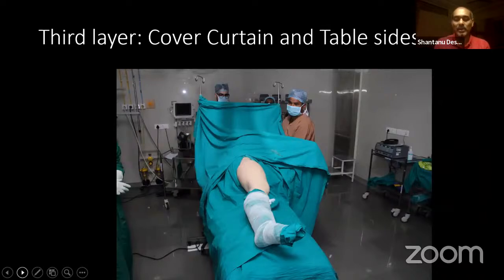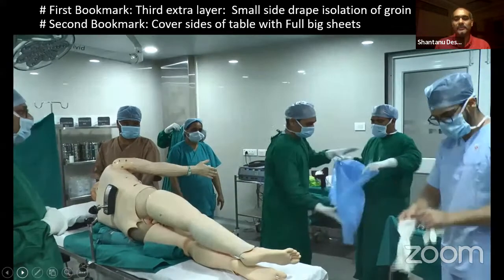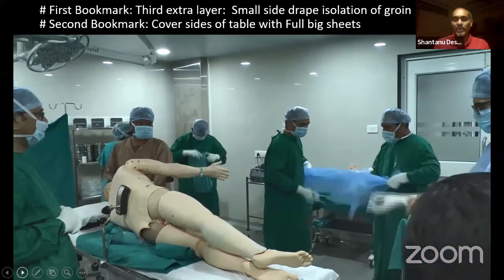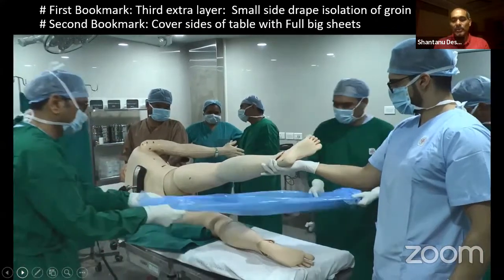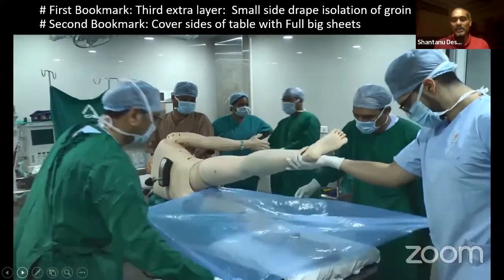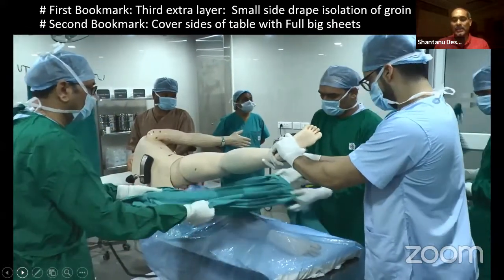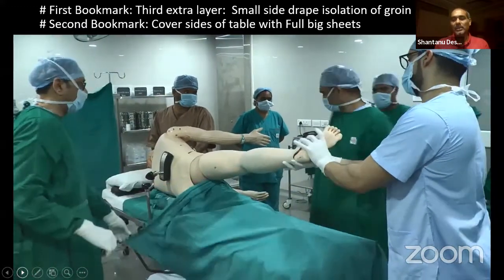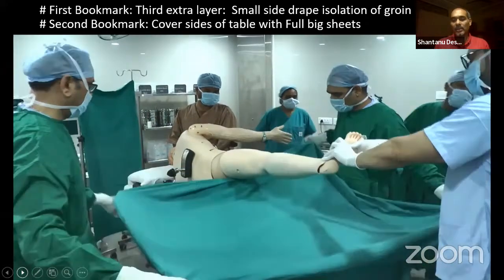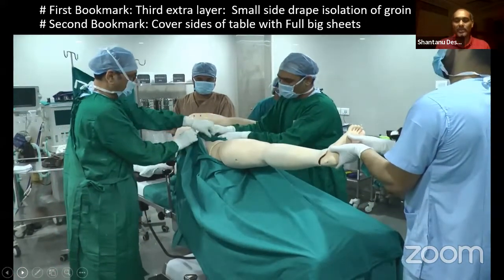You will need 3 or 4 long big drapes to cover the hip in lateral position, as well as a few short drapes. So the video basically would show you these steps in detail. So whenever you're using this plastic sheet, make sure it covers the entire lower limb and both sides. Now the first cloth drape that comes is covering again the plastic sheet and ends. A second long big drape comes.